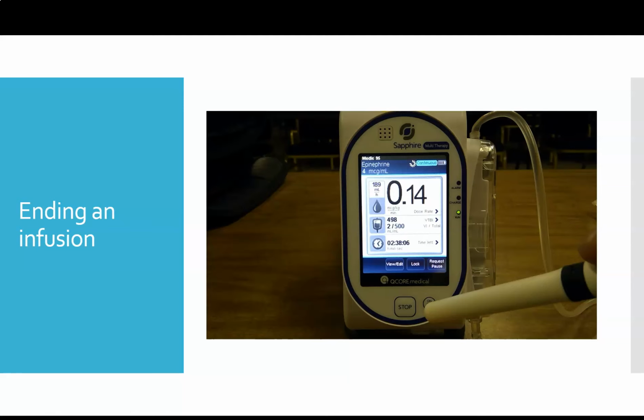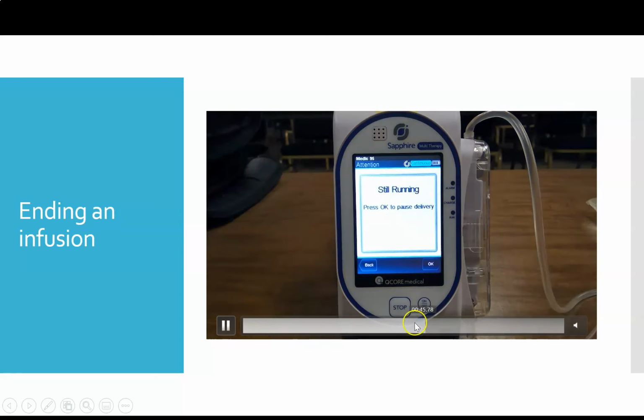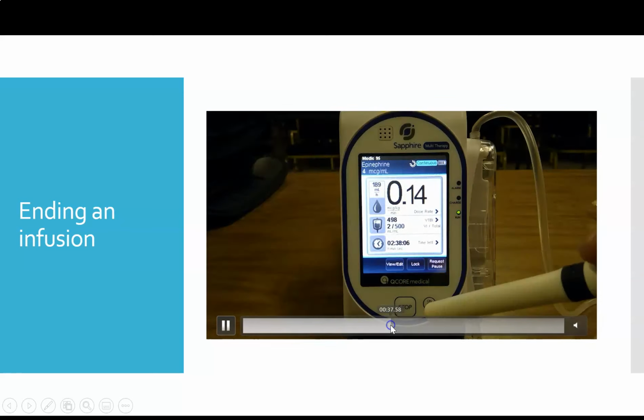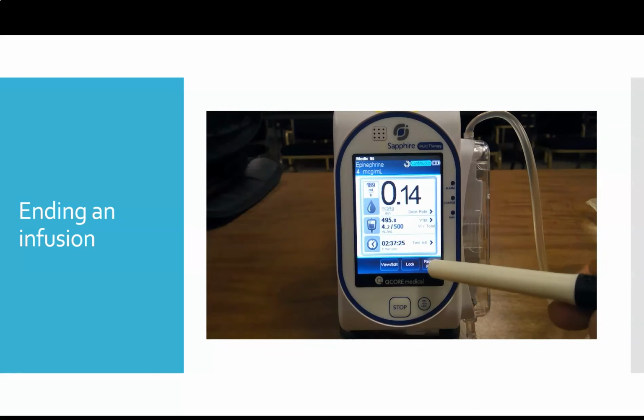All right, so how do we end an infusion? What we need to do to end it is we first have to request that it pauses. Oh, I'm not sure why that video kind of stalled there for a minute, but we're going to go in here. We're going to click request pause.